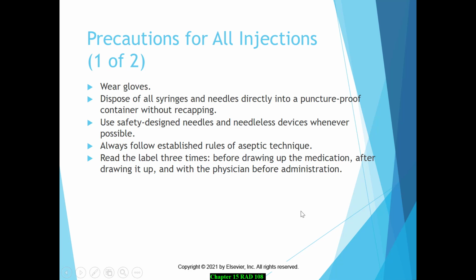Make sure that you always have gloves and that you're disposing of those syringes directly into that puncture-proof container without recapping, so that you avoid any needle stick injuries. If you do have a needle stick injury, you do need to report that right away and fill out an incident report. And then you'll follow hospital procedures at that point for what to do for a follow-up.